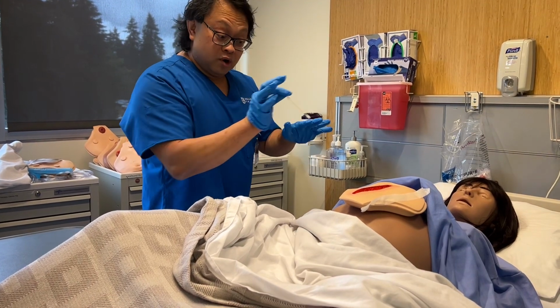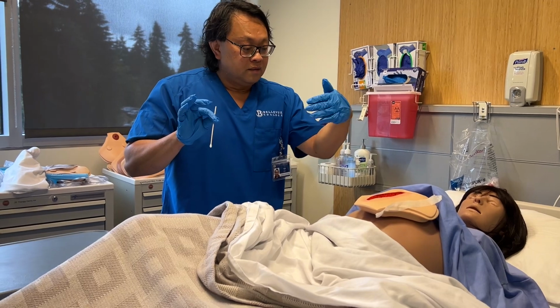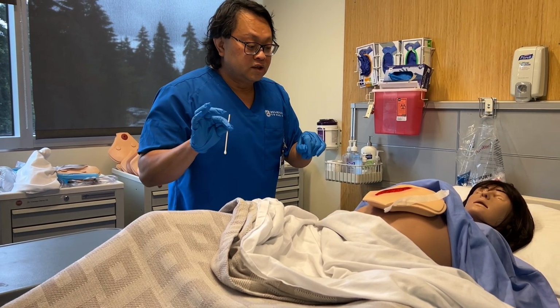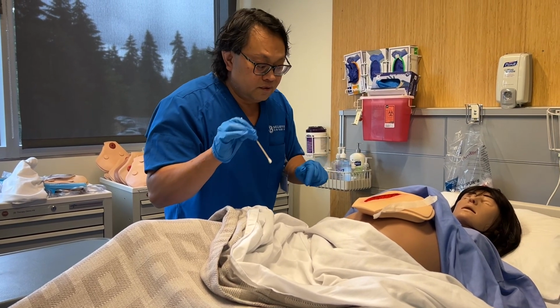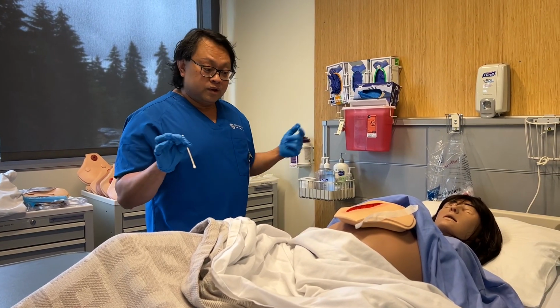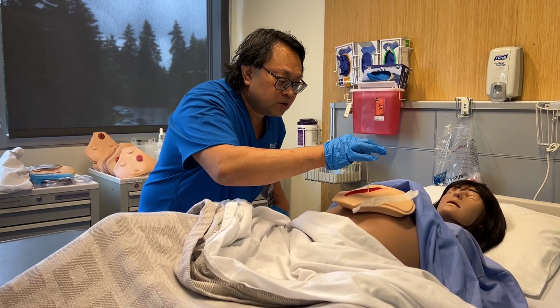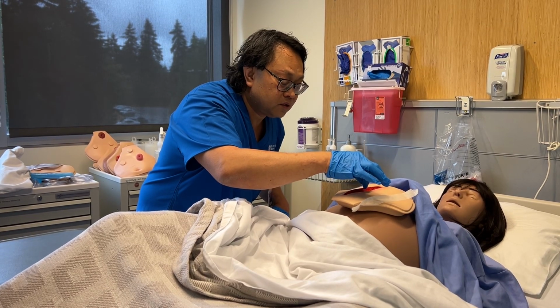And we're also checking the layers of the outside boundaries of the wound for skin integrity, for lesions and infections and pus and all that stuff. It looks healthy and fine. If there was any extra drainage, we would clean that up too and document that with the rest of the drainage. And then we would measure, making sure not to touch the side of the wound that could hurt.